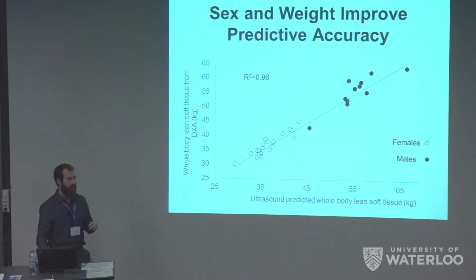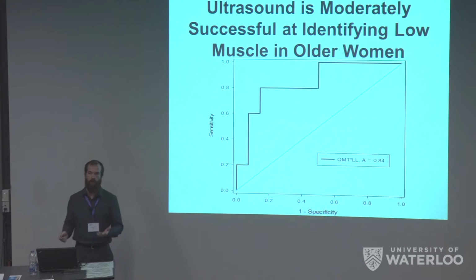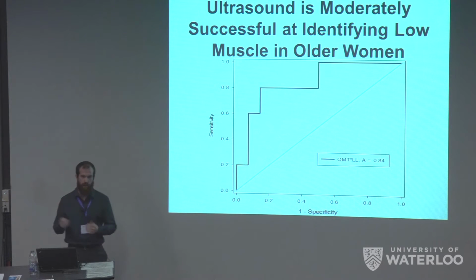And so we performed an ROC analysis. Now this was only performed in our older women, as we didn't have enough male participants to actually conduct the analysis. But we always need to keep in mind there were still only 19 females so far that we've recruited, and only 5 of them were below that threshold. So just keep that in the back of your mind as we go over this analysis.